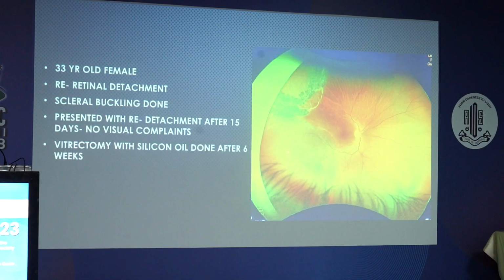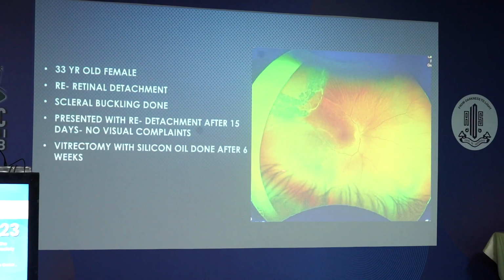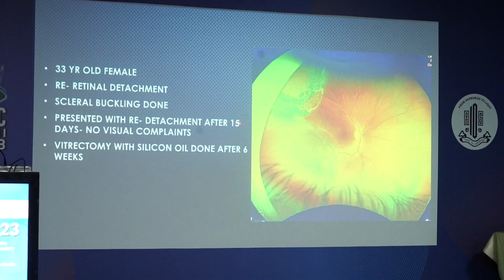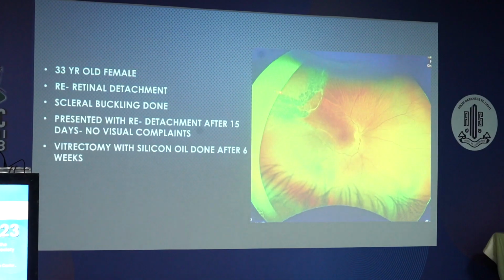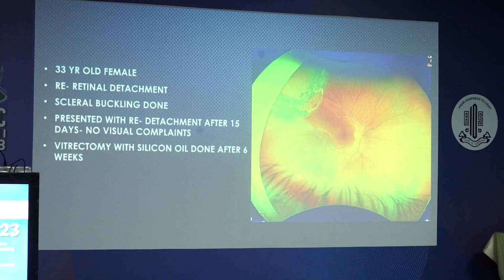Yes. So what we do is, when you look inside, and suppose the cyst is still elevated and you presume or suspect a break somewhere here, drain the cyst also. You can do it externally, like drainage, by poking through with a needle externally in the sclera. Then this fluid comes out and this gets flattened. But if it is away from the break and you are sure the break is somewhere here, you have done the buckle, within a week this cyst will flatten on its own. You really do not have to drain, because it's due to chronic detachment. The moment the retina attaches, this also collapses on its own. But if mechanically it is holding the break up, then it will not allow the break to flatten, not allow the retina to settle.